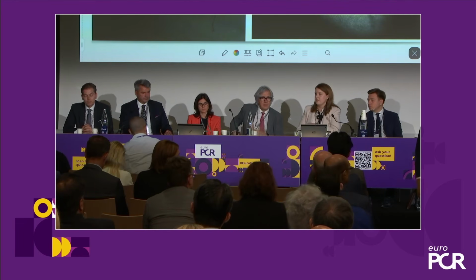I think that we should mention also that with ultrasound, we can see the calcification and know if we want to use rotablation or not, if we want to use IVL or not. So it's additional information which is impossible to differentiate based on angio. I think it also increases patient safety as well. If you're using these additional techniques, then I think you're less likely to cause harm to your patients.